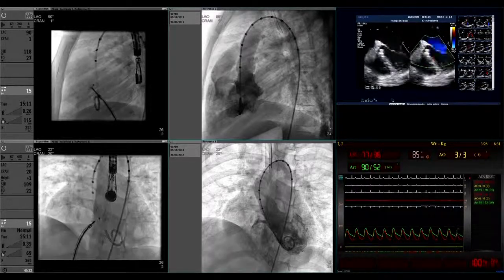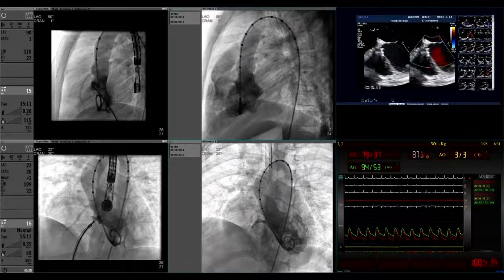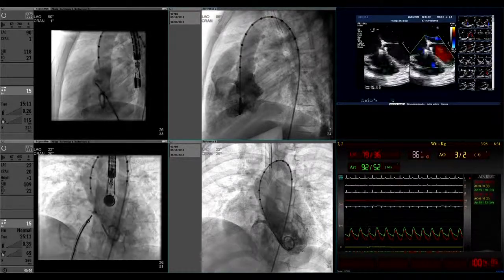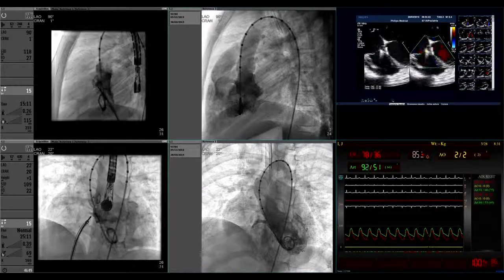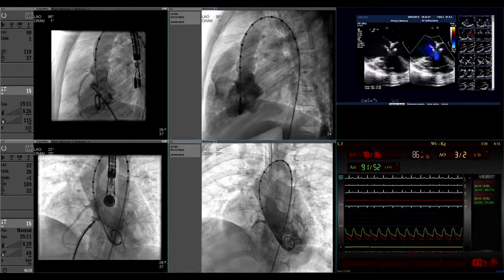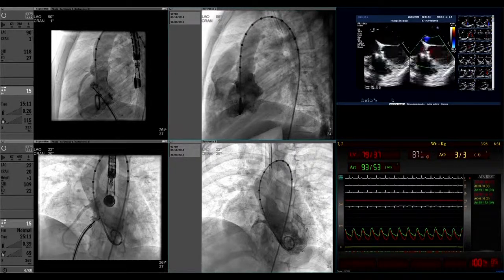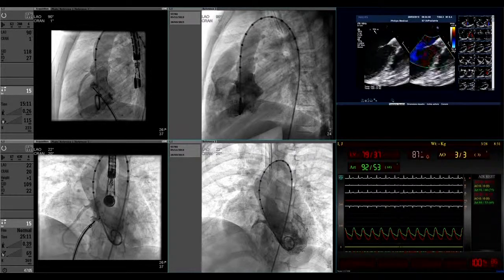Please go ahead. Yep. Thomas. Yeah, Bharat, you see on the lateral view, can you see the device a little bit pointing downwards? Yeah, pointing down due to the cable. In lateral view, you see some residual shunt. Is the Occlutech long shank device an option, to have a longer body of the device to give more security, and also the body has a slightly different shape, which may give more stability?